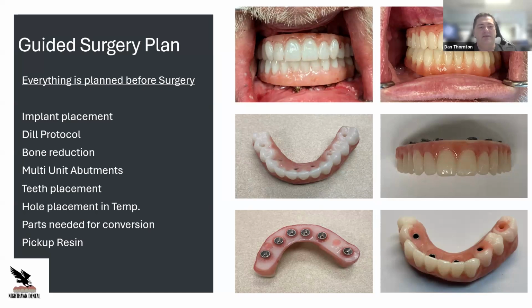There are going to be a lot of different products out there for you to use. You almost have to use them and see which one you like, which ones the doctor likes. Are you having any kind of bonding problem? Does it take a special bonding agent? Do you have to sandblast certain things? Is the metal retentive enough to hold your acrylic or your material together with that prosthesis?